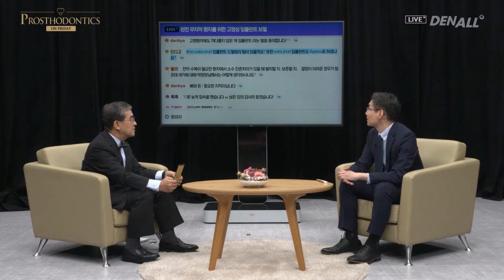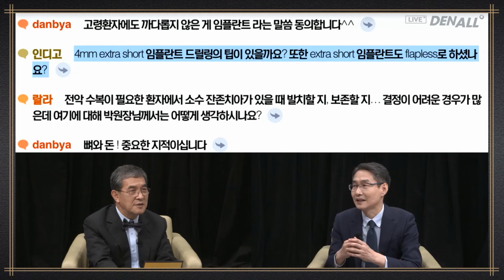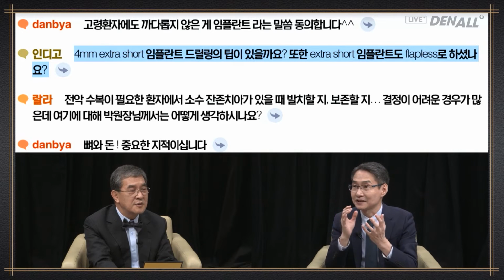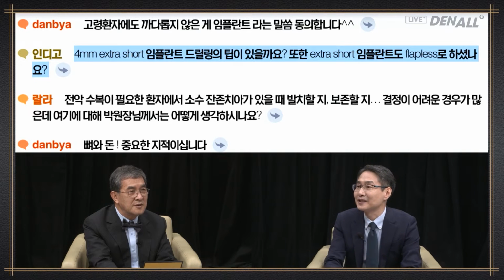When drilling is done, it is important that there's no wobbling. It needs to go in the accurate path. The drill hole size and the recommended drill size need to accurately align. This is very important. When the implant is placed, the surface of the implant, the threads, need to be in close contact with the bone. I think that's the key.